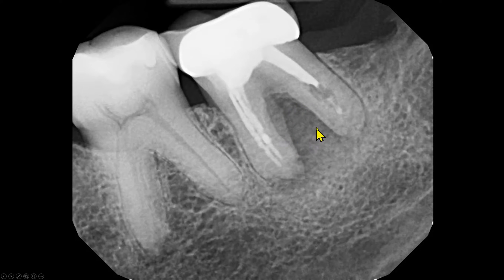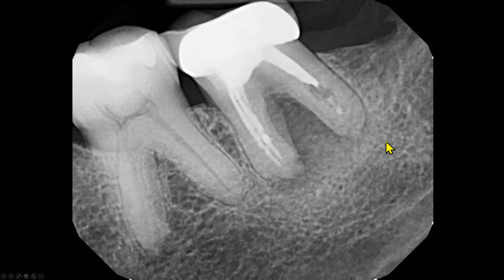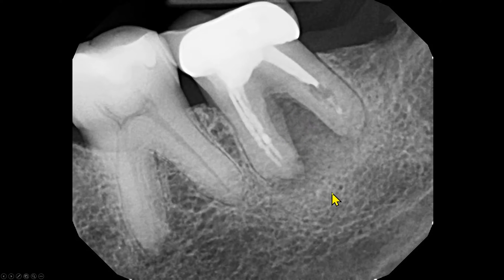We are also unable to define the border of the radiolucency — maybe the radiolucency ends here, maybe it ends here. These radiopacities have different shades of gray. Such findings are called zone of transition. So we have two findings here: one is the area of low density, and one is the area of increased density.